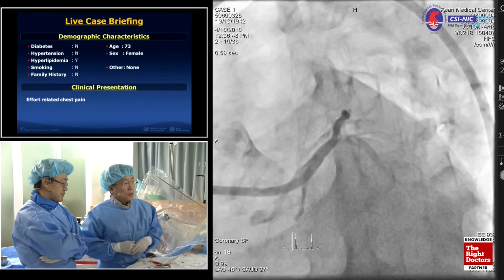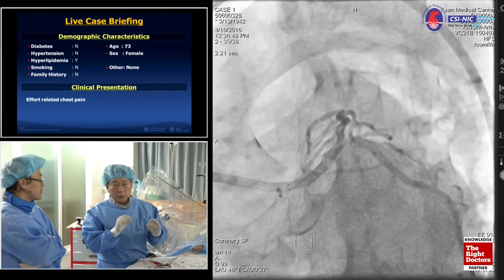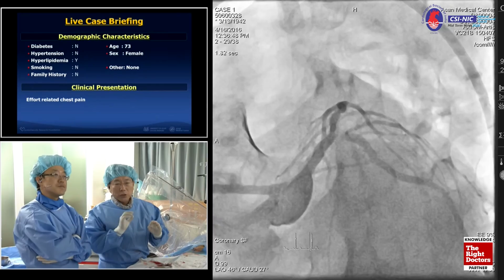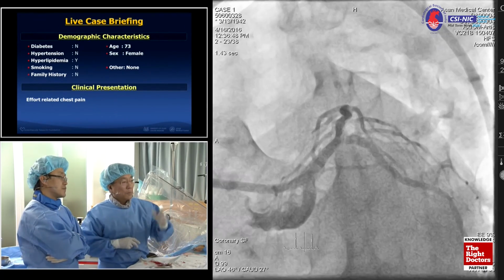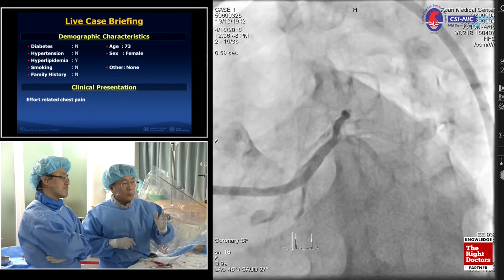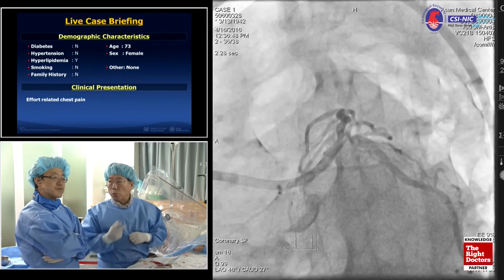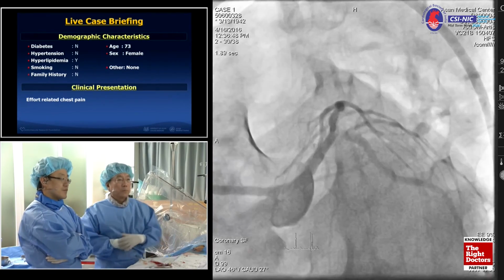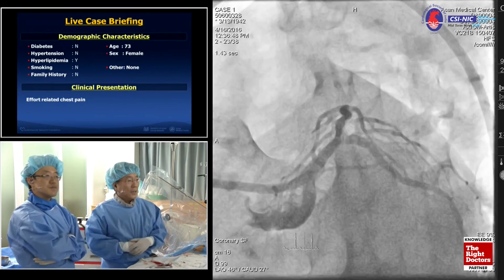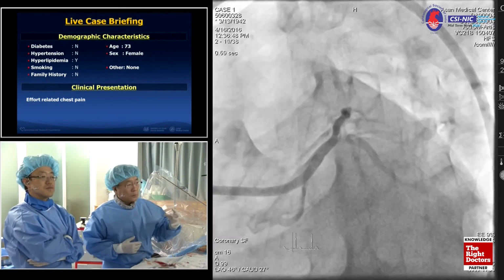So we are going to treat the restenosis of the circumflex ostium, the non-stented segment, and we have to consider again the stented segment from the LAD to the main. This is the stent crossover of the circumflex ostium. Any discussion, any suggestions?